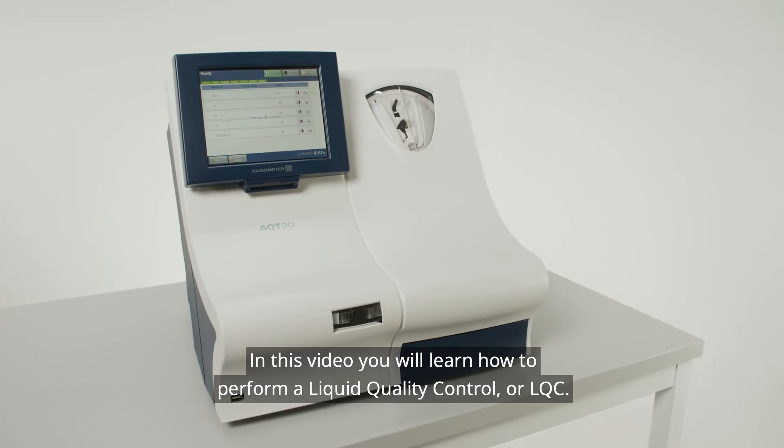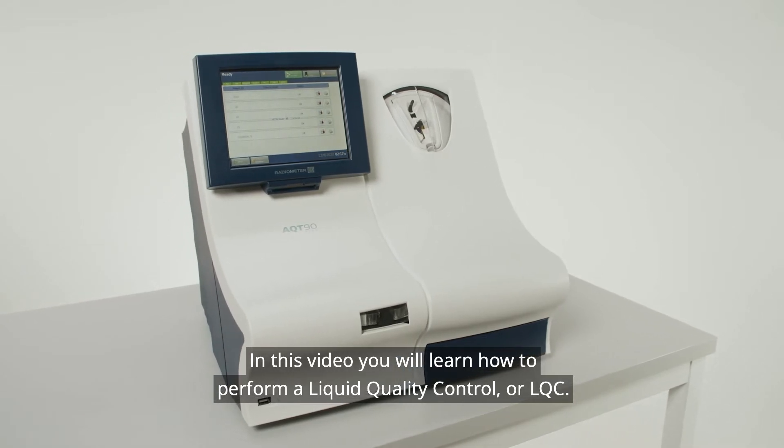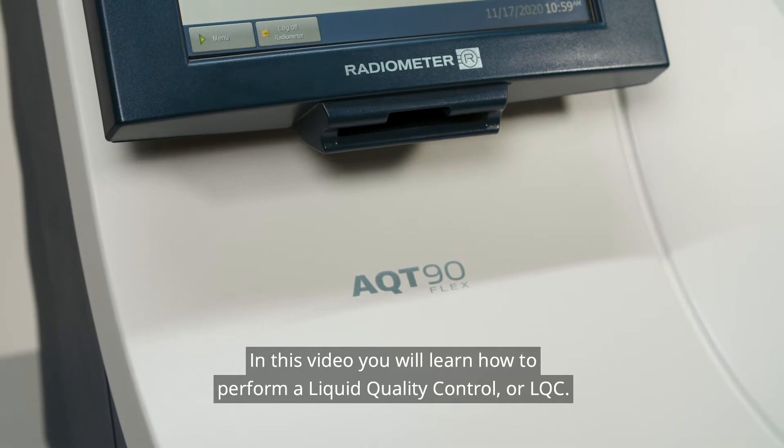In this video, you will learn how to perform a Liquid Quality Control, or LQC, on the AQT-90.